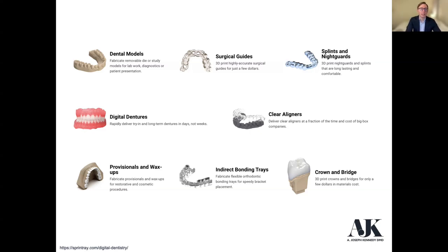So dental models, surgical guides, occlusal guards, digital dentures, which is really kind of that up and coming thing that we're seeing a lot of these labs, NDX included, moving toward, clear aligners. Ortho, I think, has really set the game off here with how they've utilized this technology in their office and doing batch printing of trays and sequences to do in-house clear aligners.